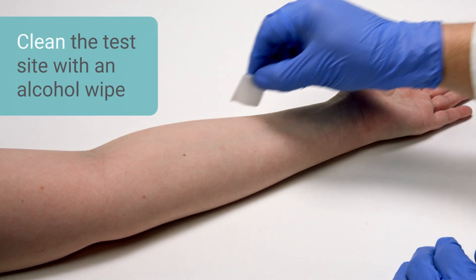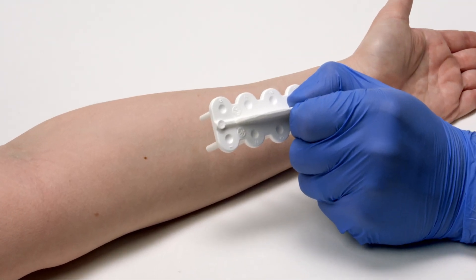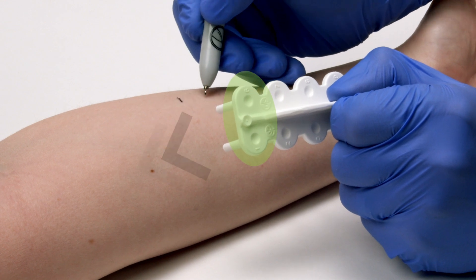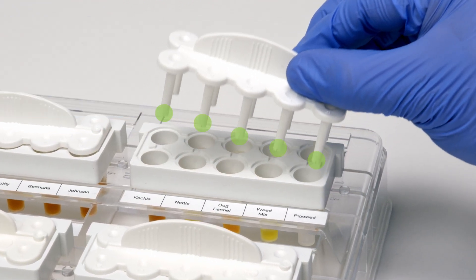Clean and dry the test area on the patient with alcohol. Always place the test device handle with the small indented circle plus the numbers 1 and 6 facing upward and toward the patient's head. Carefully remove the device from the prepared tray, taking care not to touch the tips on the reservoirs or spacers.